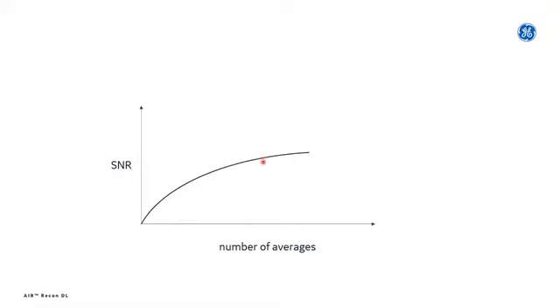That curve plateaus over time to the point where maybe there's not a lot of difference between going from a 10x to a 20x when you have a large number of averages. And so it goes as a square root behavior. Doubling your number of averages only results in a square root of 2 of your SNR. You've done MR and you know this rule pretty well.